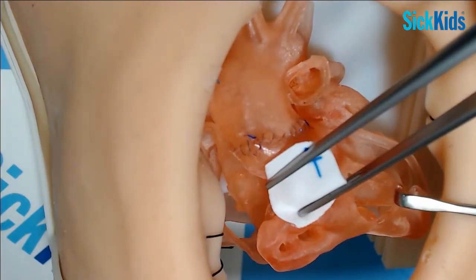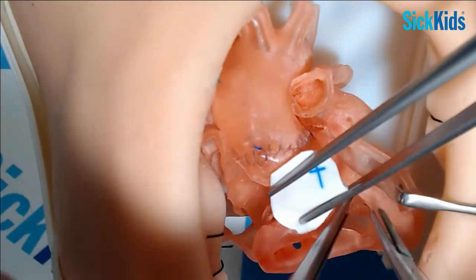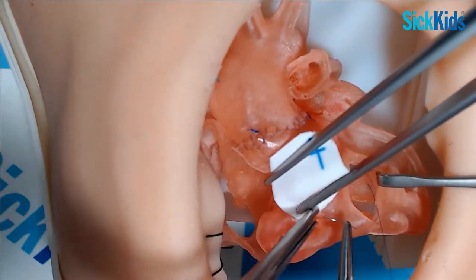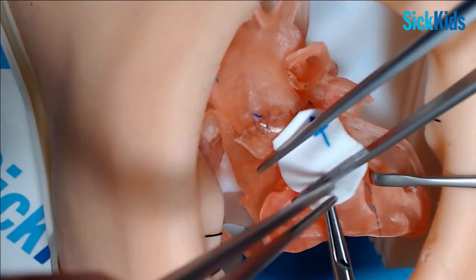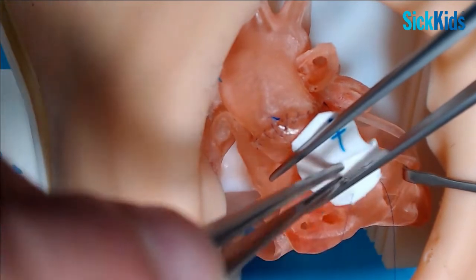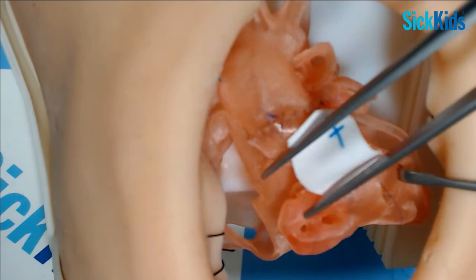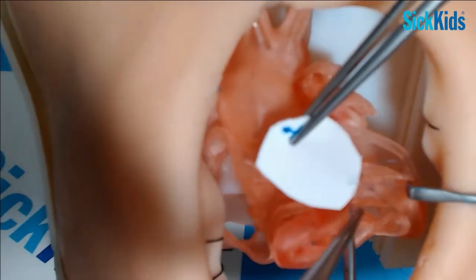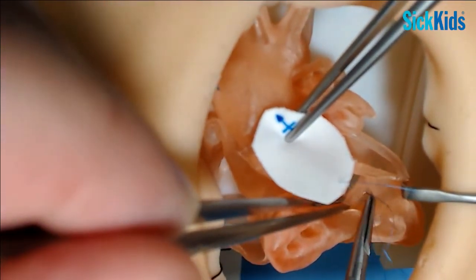So I'd probably start on the distant side of the VSD, or the part that's furthest away from the trunk, and get your patch down, and then we're away. As I say, because we haven't got to worry about the conduction, you can just stay around the margins.